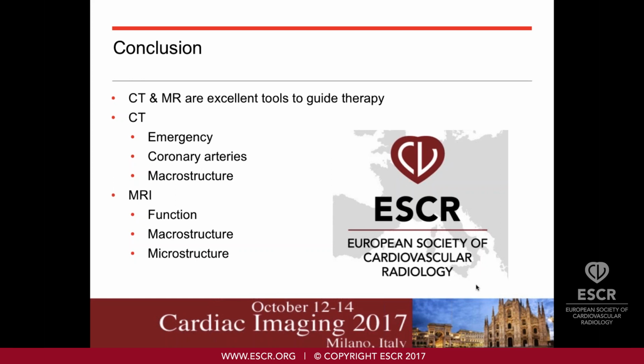I don't know, what would you answer to this? So we have a standard 3D angiography sequence to acquire the MR images, and then we have a specific homemade analysis software for further characterization of the shape of the left atrium, so to do this ellipsoid.